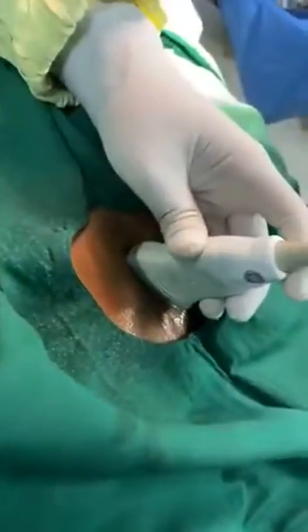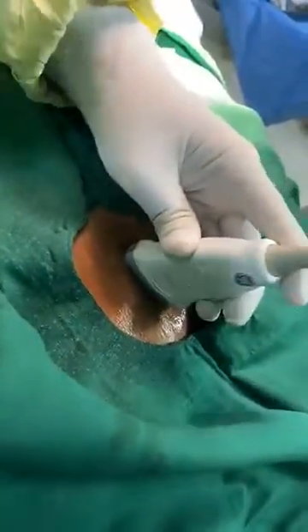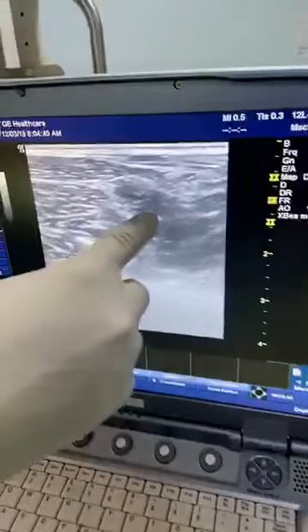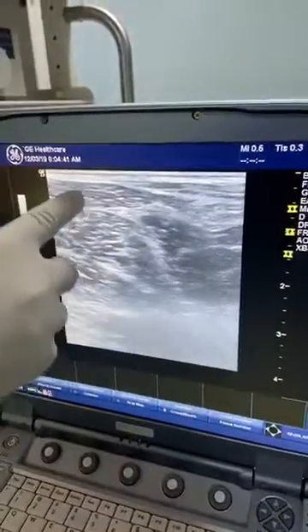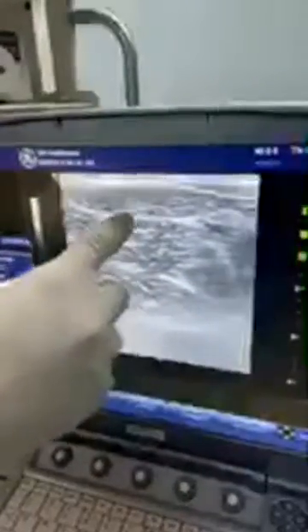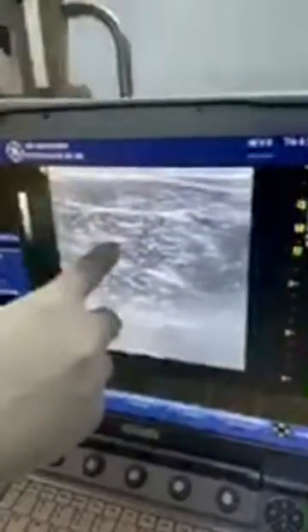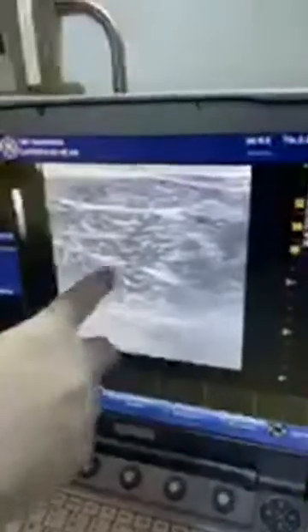I am moving my probe medially. Here you can see I am moving my probe medially. So I have gone medially and here on the screen, this is adductor longus, this is adductor brevis, and this is adductor magnus.